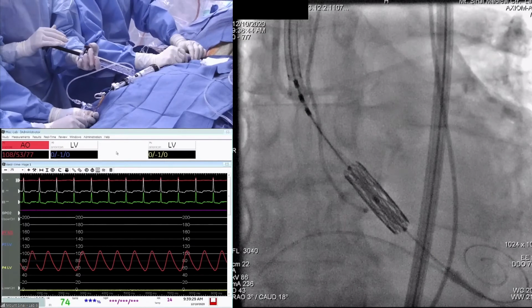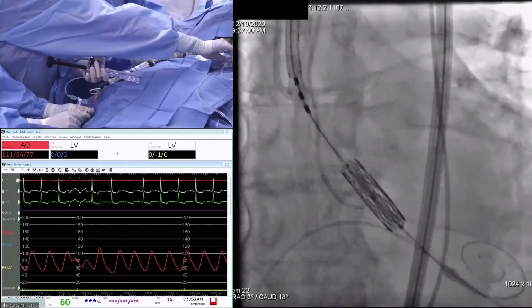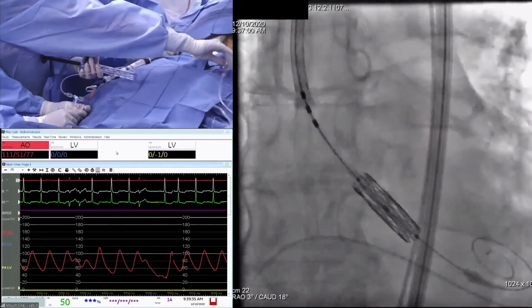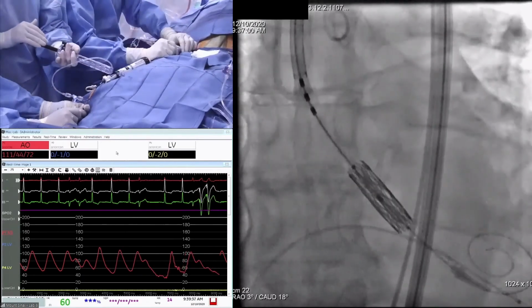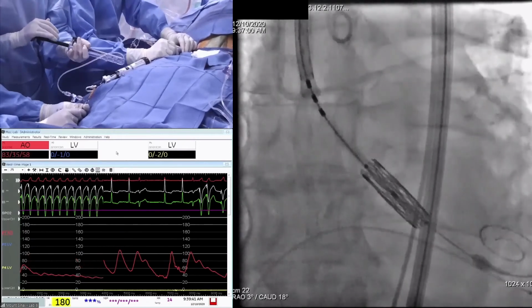But anyway, they have seen it. Position is good. Now ready to deploy. Does everyone agree on the position? Yes. Okay, I think the panel likes the position. I'm going to take the pigtail. Yep, good. So I'm ready to go up. Blood pressure is 40.